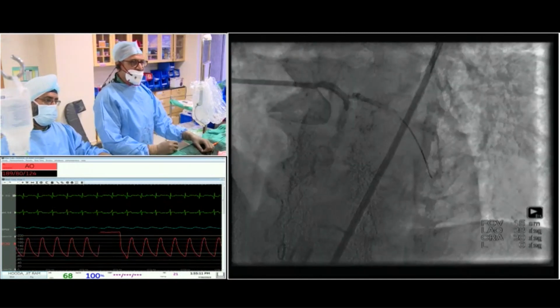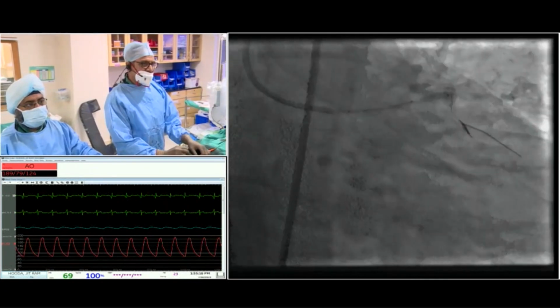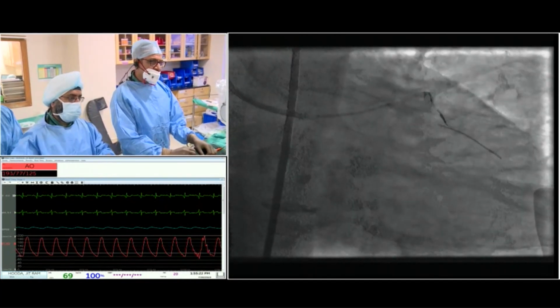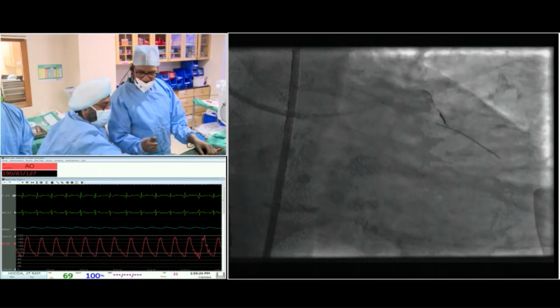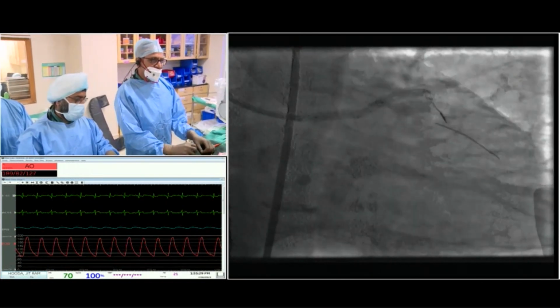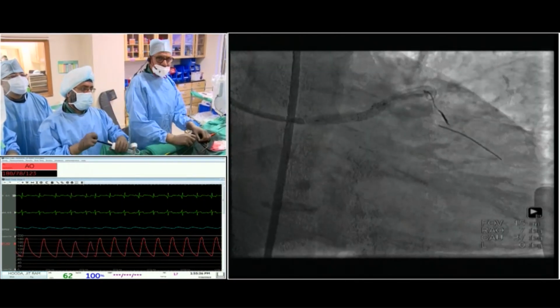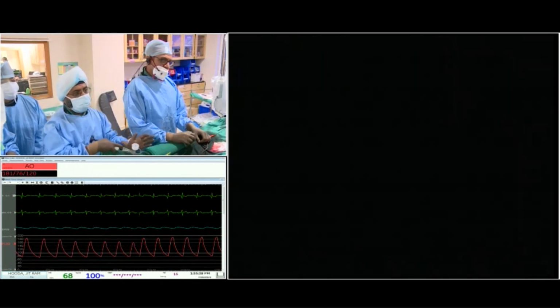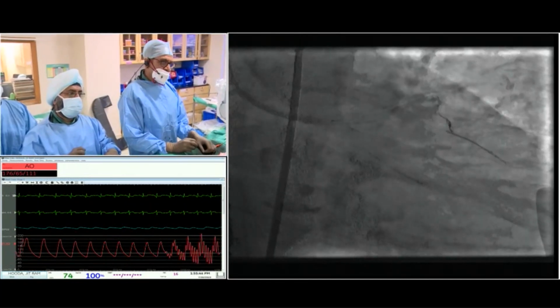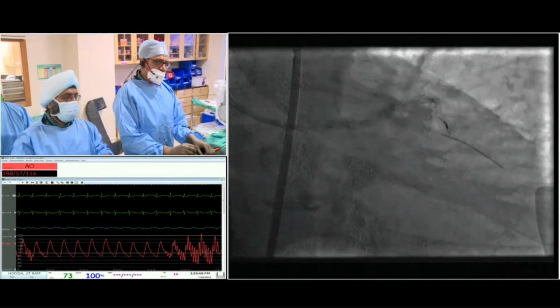Okay. And I have seen that the ostium of the circumflex is clean on IVUS. So that gives me a lot of breathing space where I deal only with the ramus. Go here. So I'm going with the 4 by 22 telescoped into the distal LAD stent. Go. Blow it. Yeah. That's it. So we've gone to 14. Okay, 14 is our pressure. Deflate. Yeah. And I do a little push on this balloon so as to dilate the interface. Go further. And give me a 4.5 by 10 balloon.